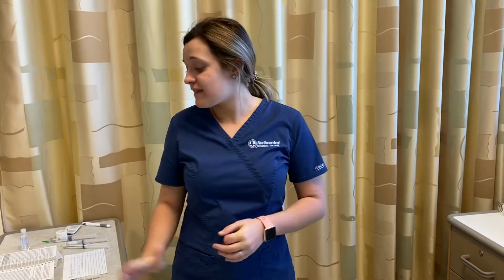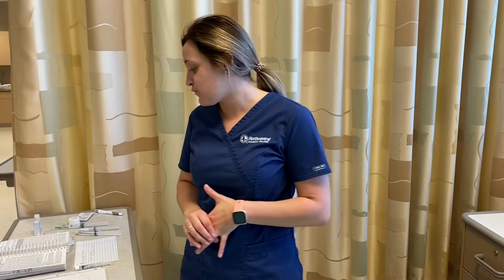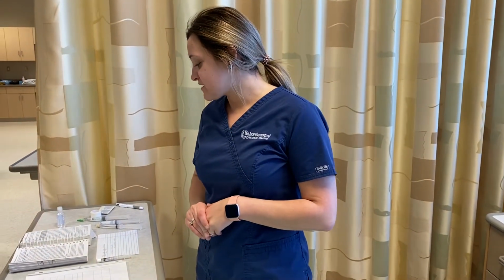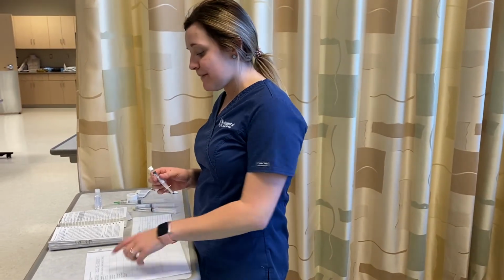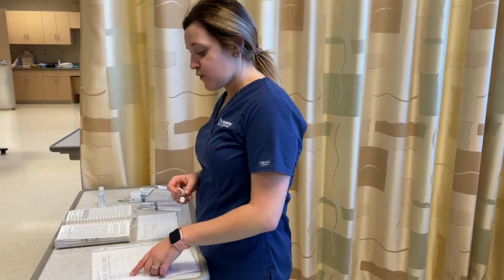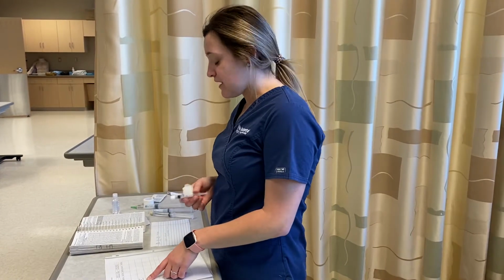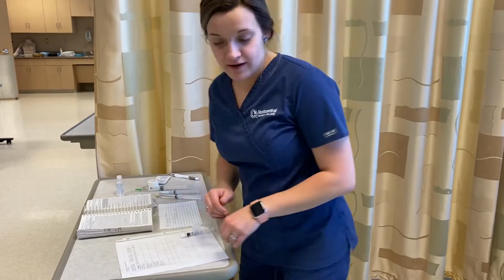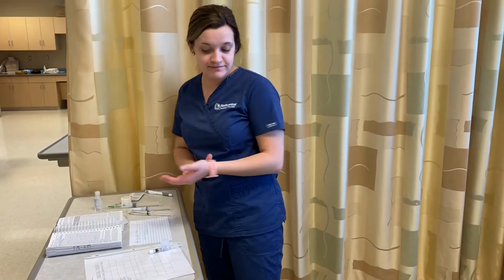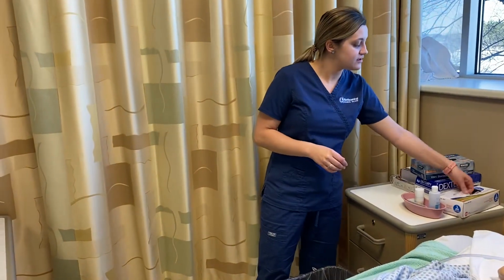He says he has an allergy to morphine, and that matches my chart, that he is allergic to morphine, and we are not giving morphine, we're giving hydromorphone. So I am going to get dose accurate again, check my 5 rights. I have Bob Owens getting hydromorphone 1 milligram IV push every 3 hours for pain to equal 0.5 mLs. He has not had it in the last 3 hours, so we're good. So I'm going to wash my hands, put some gloves on, not extra large.